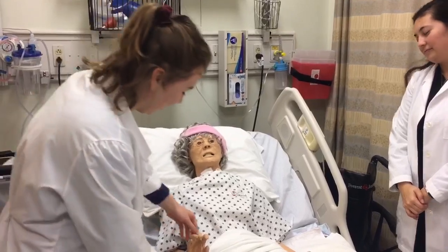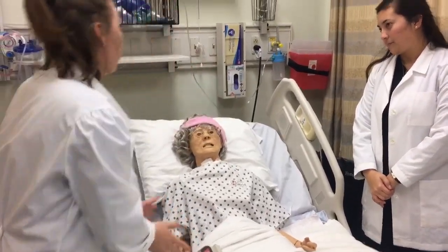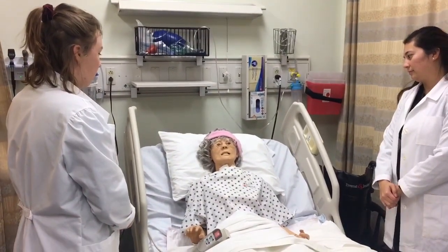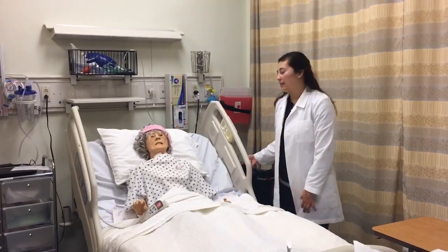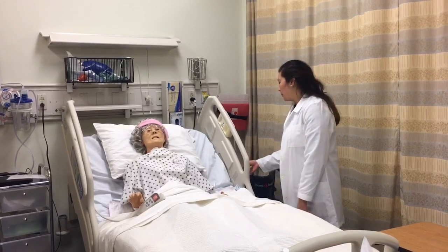Okay, I'm going to check your armband to check. Okay, perfect. Today we'll be inserting a Foley catheter. Do you know what that is? Okay, so the doctor has ordered it. I'm going to raise you up. I'm going to put your head back.